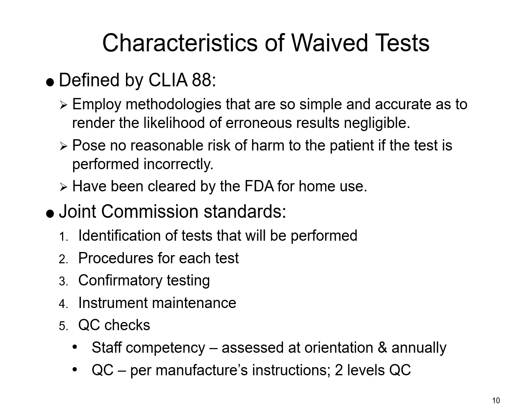So you're going to have a procedure in place for each of these tests, and of course you've got to identify which tests you will be using and performing. You have to report this to whatever accreditation agency you use. Even though it is a waived test, you still have to let them know what tests you use in your facility. This helps with tracking. If there's ever any kind of recall or issue, they know exactly who has what, or who tests for what.